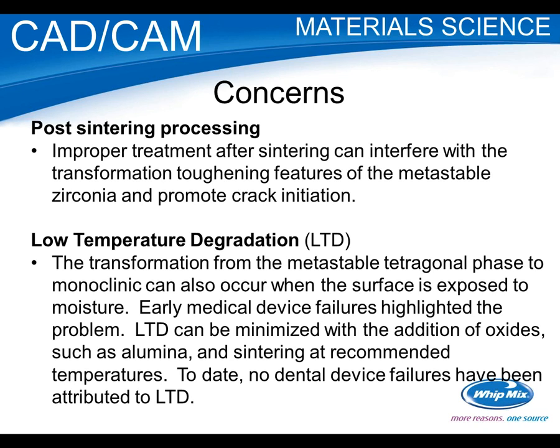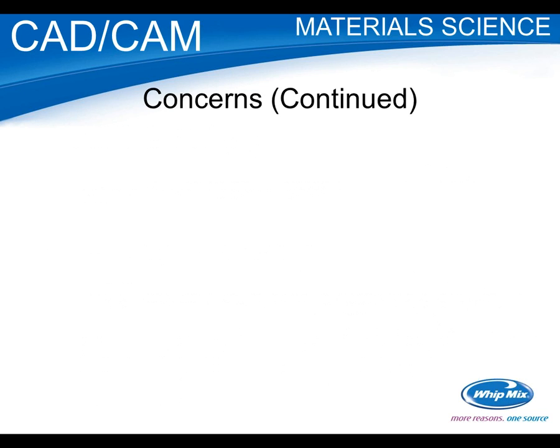When we're making a coping, we've got porcelain on one side and adhesive to the tooth on the other, so we really aren't exposed to moisture. And if we are making a full contour and we put the glaze on it, then again we've sealed the surface. So the feel is that if the surface is adequately coated and the zirconia was processed correctly, that really is a minimal risk, but I need to point that out.